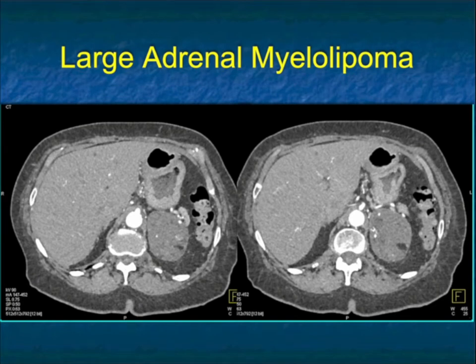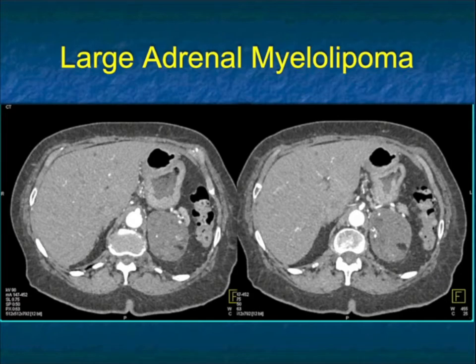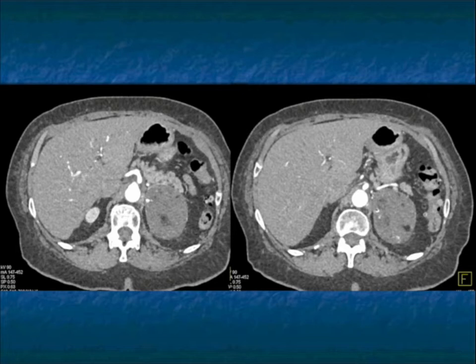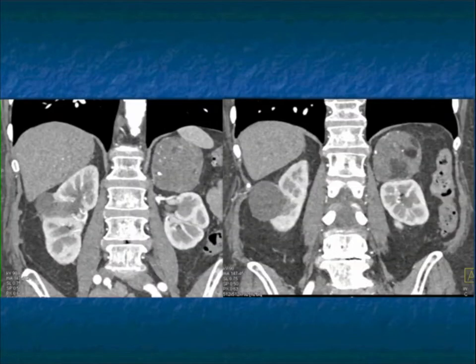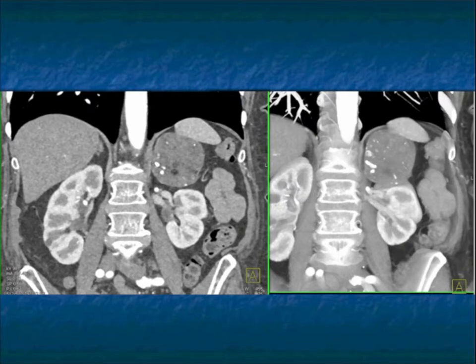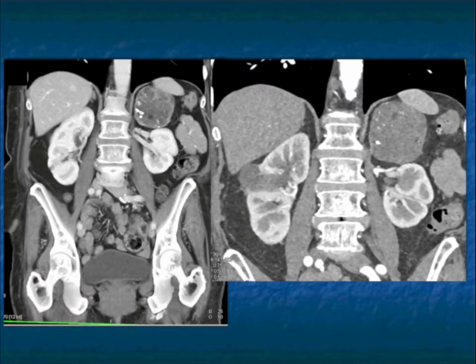Here's a large left adrenal mass with calcification — punctate calcification, not dystrophic calcification — and fat. Could this be an adrenal carcinoma? When I see a well-defined lesion, incidental finding, multiple foci of fat, and punctate calcifications, it's a myelolipoma. Myelolipomas can be large and are typically incidental findings. You can see it very nicely in the coronal view. The punctate calcifications make the diagnosis comfortable. This was confirmed as a myelolipoma.